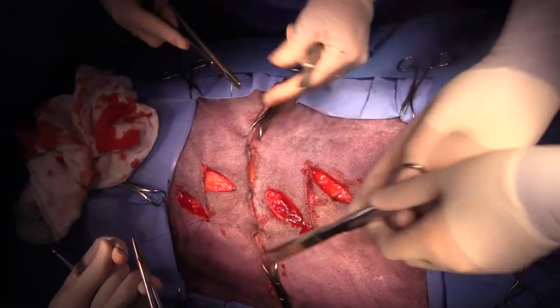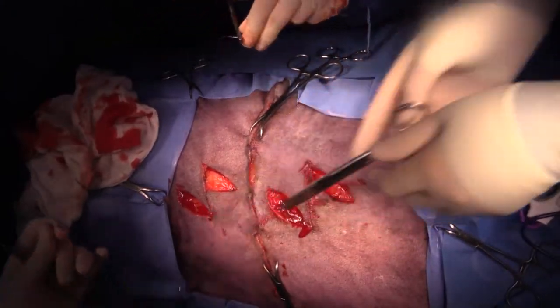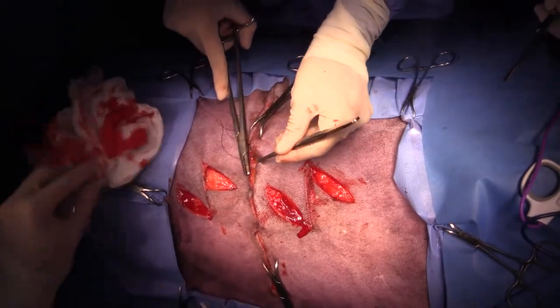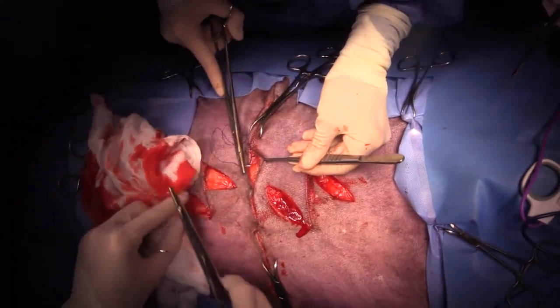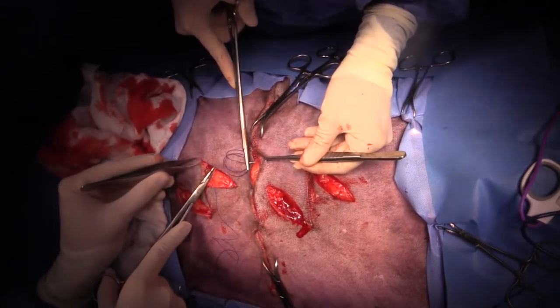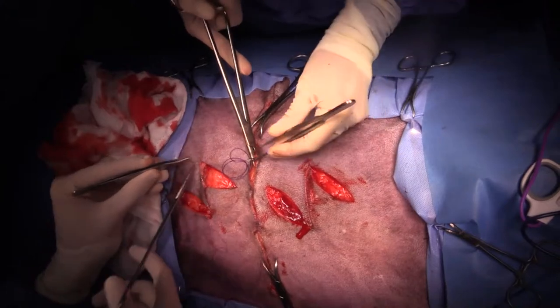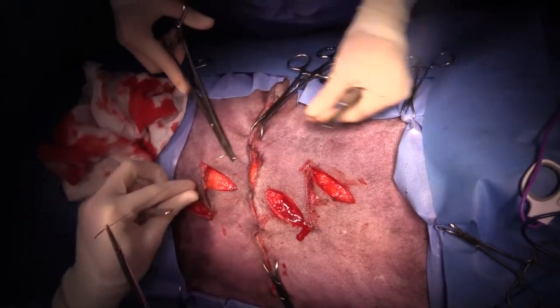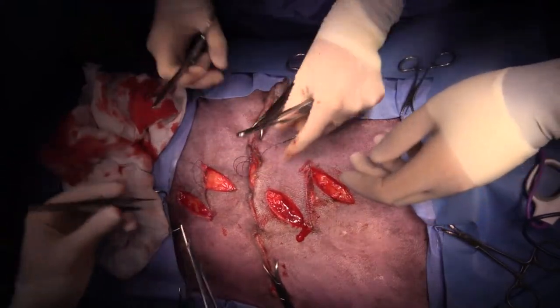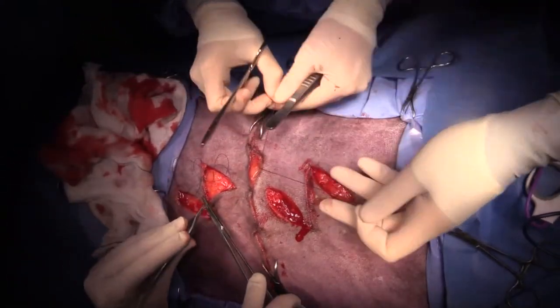Another question. So long sutures deeper to your sub-Q layer, then close routinely, followed by rolled gauze over the incision and tie the long strands on top of the lap sponges, provides added tension and absorbs mild discharge. Interesting. I've seen those. I've seen Bryden Stanley do those before. I haven't done them before.